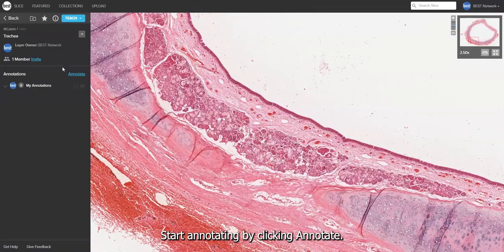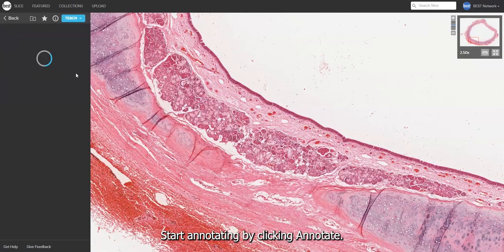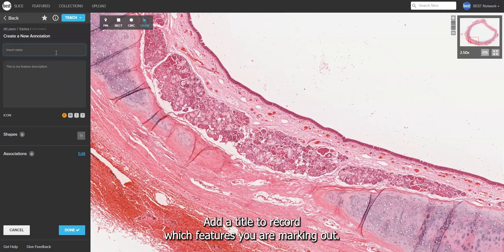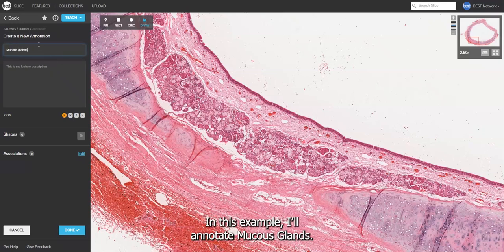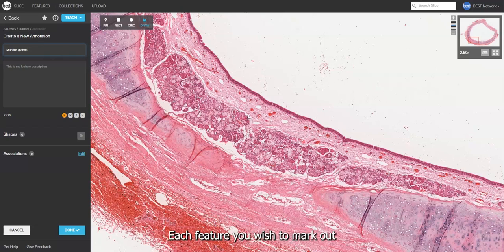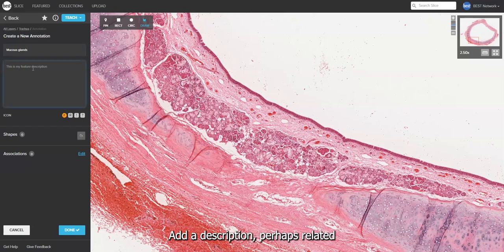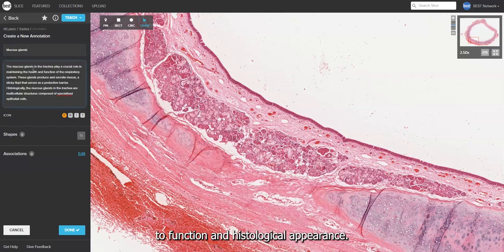Start annotating by clicking Annotate. Add a title to record which features you are marking out — in this example, I'll annotate mucus glands. Each feature you wish to mark out needs to be a separate annotation. Add a description, perhaps related to function and histological appearance.